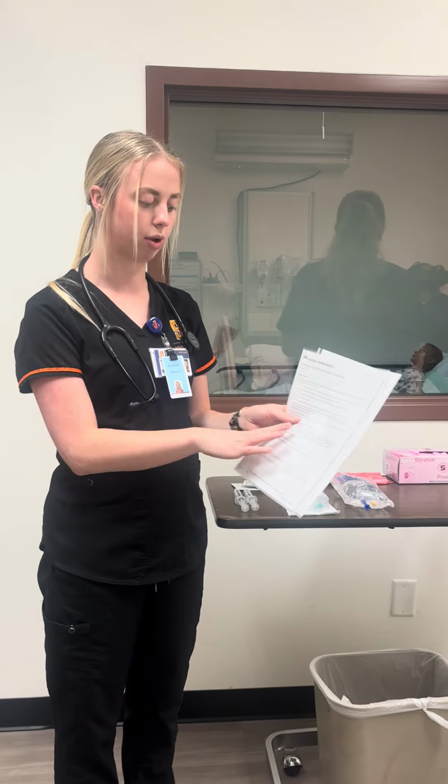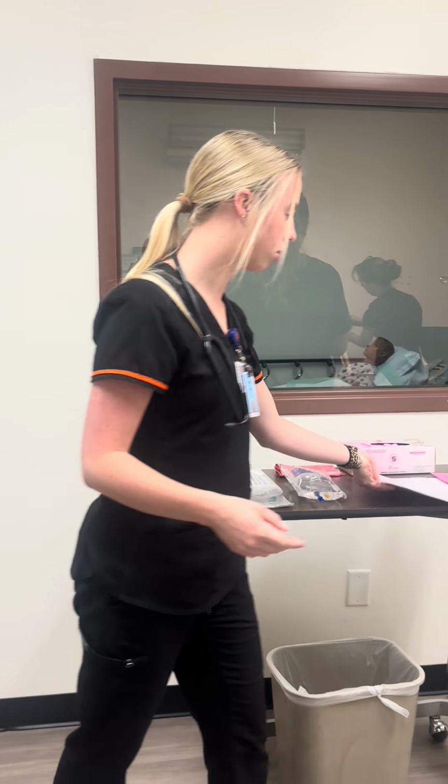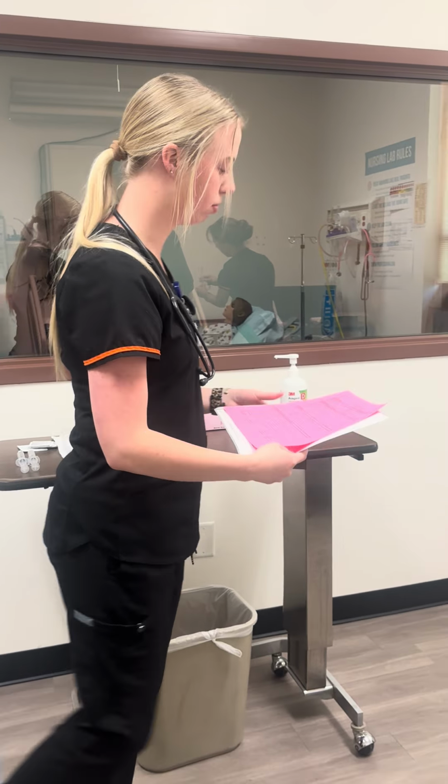I also want to ensure that we have consent signed, as this is crucial for our patient to have done before we're giving this blood. So now I'm going to take these into the room.